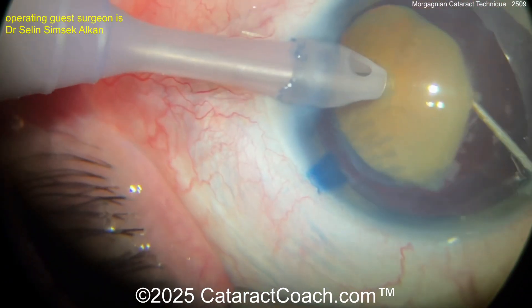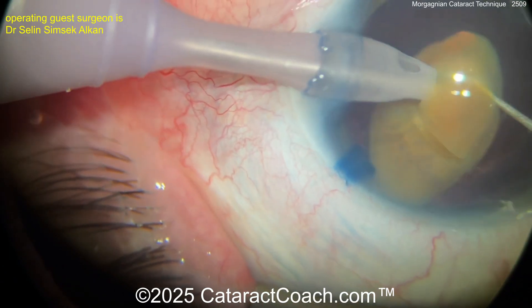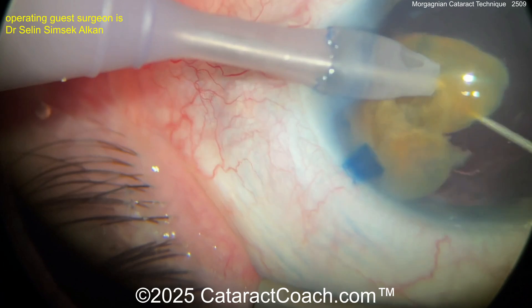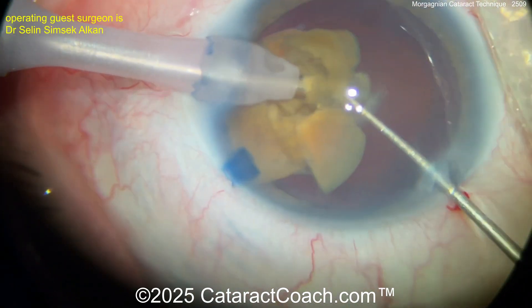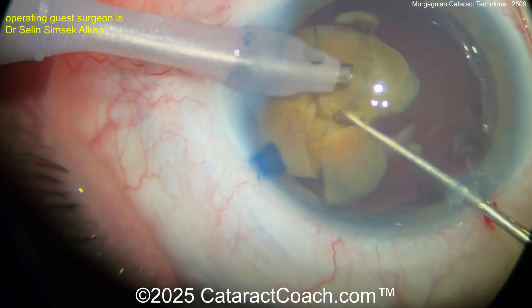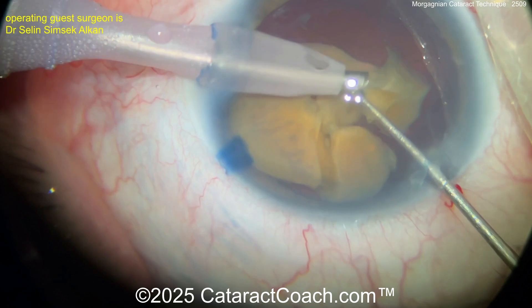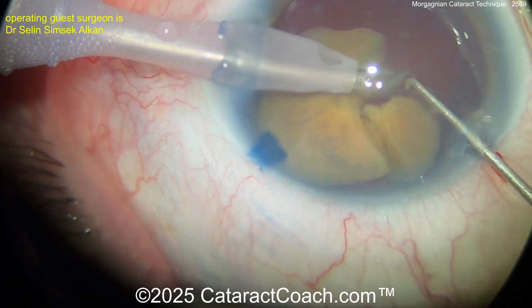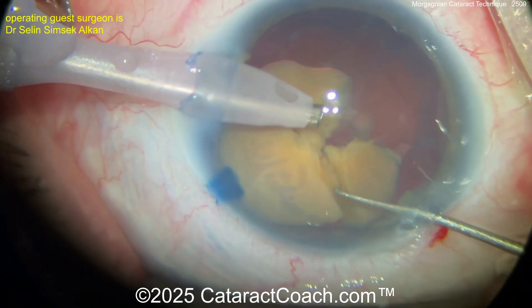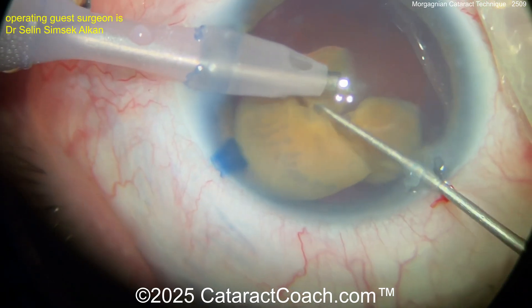Good buzz, good grip — bring it up. Chopper going behind it. Oh I love it! Beautiful technique. I'm like a cheerleader here — I'm having so much fun. You know how much fun I have looking at these videos. Now you've kind of broken it up, but again there's some density to that central endonucleus — that endonugget, if you will. So it's still somewhat attached, but the surgeon is certainly being persistent.